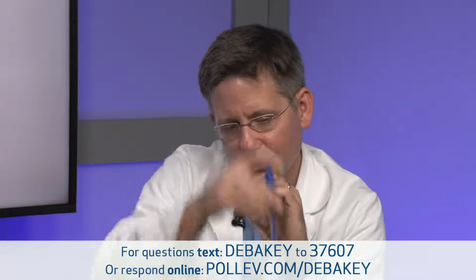What does that mean? Well, almost always what that means is that they've gone through the fistula, kind of like in the pseudo-aneurysm case you've seen. Now the needle's sitting outside of the access. It's bled back there, so there's blood. Generally that blood stops flowing and creates a hematoma, and as they're drawing back on the syringe, they're actually sucking clots from the extravasation out through the needle. So there's not really thrombus inside of the access, but just some thrombus outside, just hematoma, which is what we hope those pseudo-aneurysms turn into. So most of the time that's a success. And it really almost always means that they've just gone too deep.